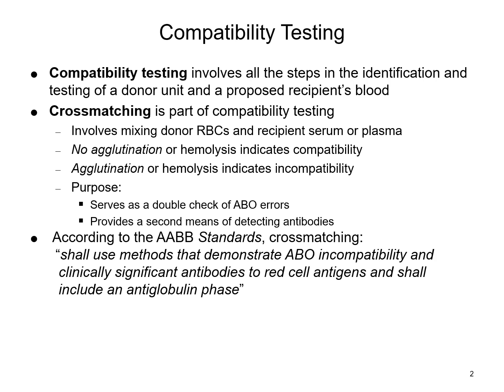So when you're actually resulting this testing, you're going to determine that the unit is compatible or that it is incompatible. So that's how you will actually result that unit as compatible versus incompatible. So that's what we're looking for, compatibility and incompatibility in the world of transfusion medicine.